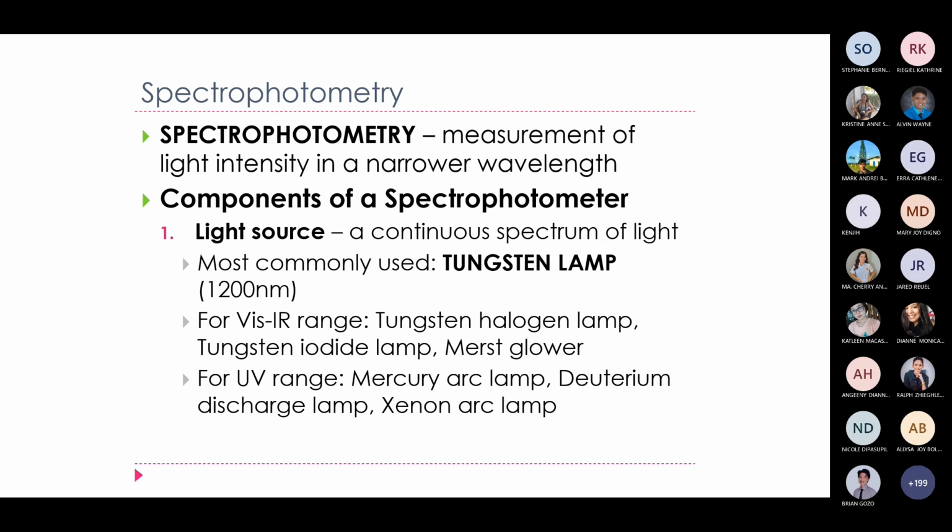Kapag quartz halogen, ano kaya siya for, hulaan nyo na lang, UV or infrared? Okay, for quartz halogen lamp, it's for infrared. For infrared light. Okay, next.